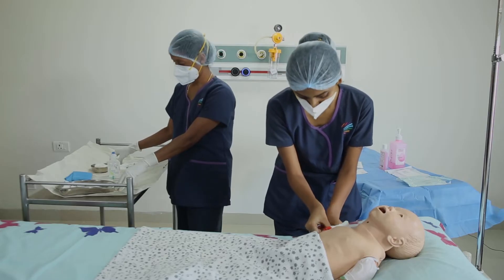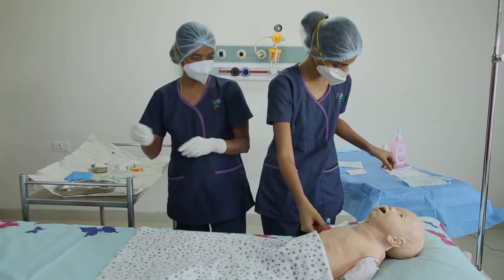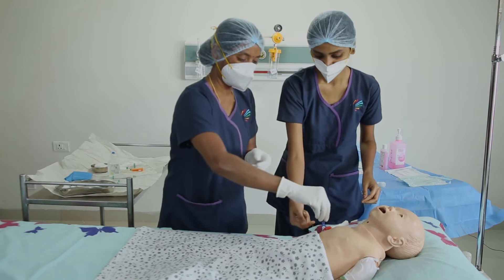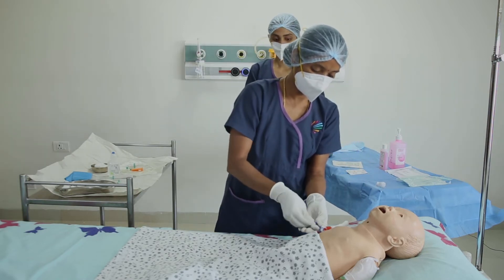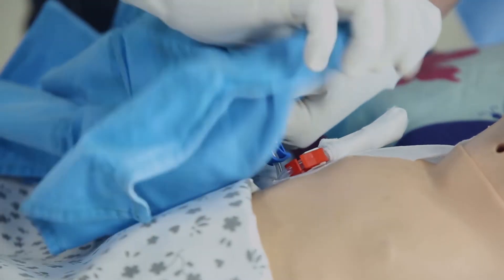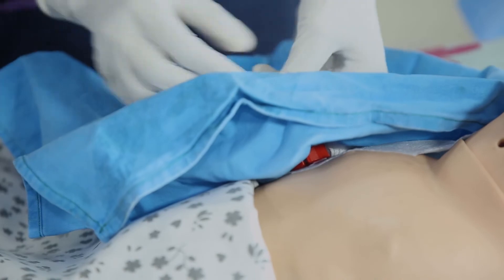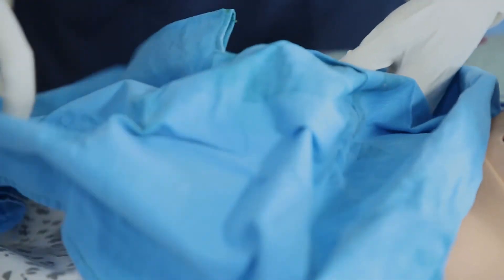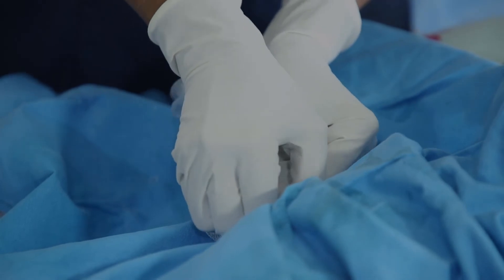After the assisting nurse opens the line hub, she will clean it with an alcohol swab for at least 15 seconds and let it dry for 5 seconds. She will then place a whole towel and take a 10 ml syringe and connect it to the line hub.